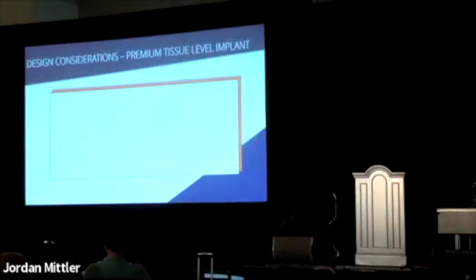So when I talked to Dytron, must be about 1.5 years ago, and actually Dr. Jensen and I had a nice conversation, a couple of them, about what the perfectly designed full arch implant would be, which I don't believe is in the marketplace today. I don't think anybody has ever designed an implant specifically for full arch. I think they have designed implants for conventional crown and bridge and converted them over to a full arch implant using transmucosal abutments.